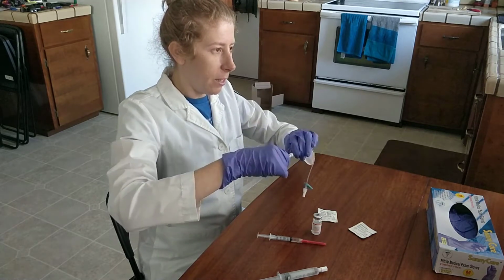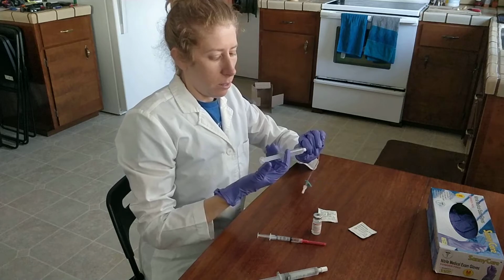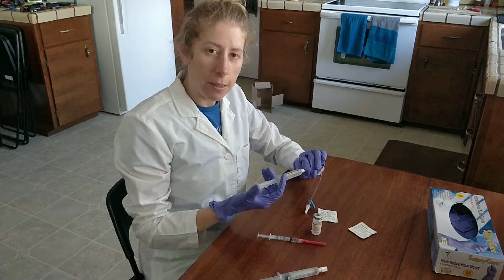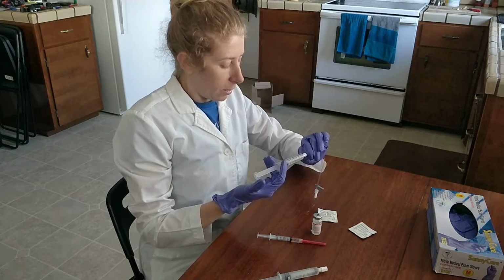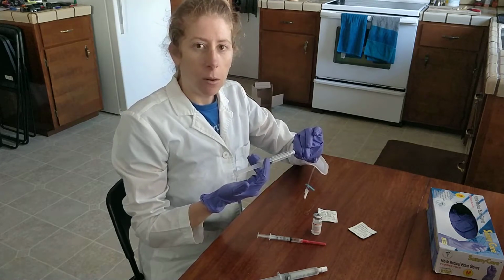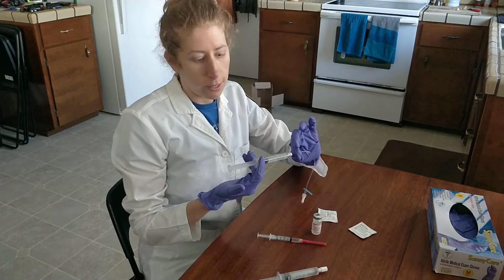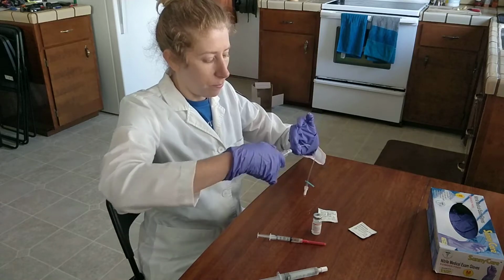Aseptically connect it, aspirate for blood return, and then slowly push 3 milliliters of normal saline into the tube. If the patient reports any pain or I meet resistance, I'm going to stop and assess the reason. Otherwise, I'll continue push.